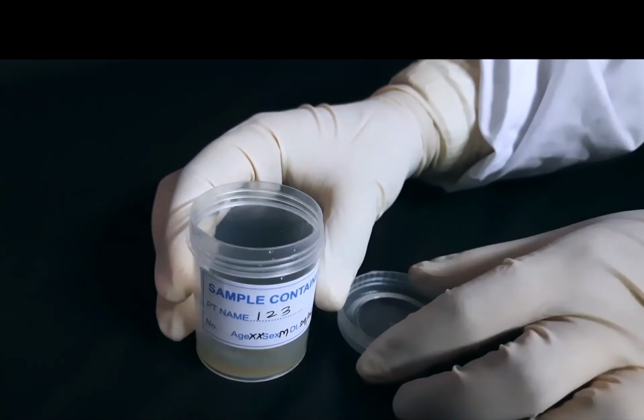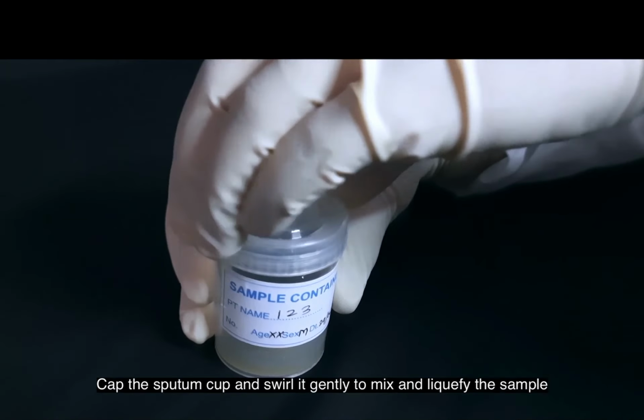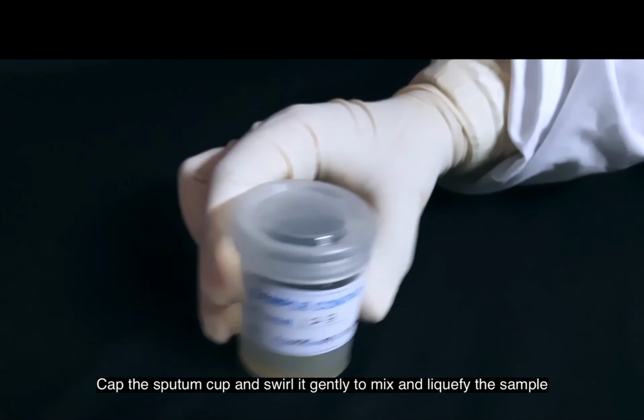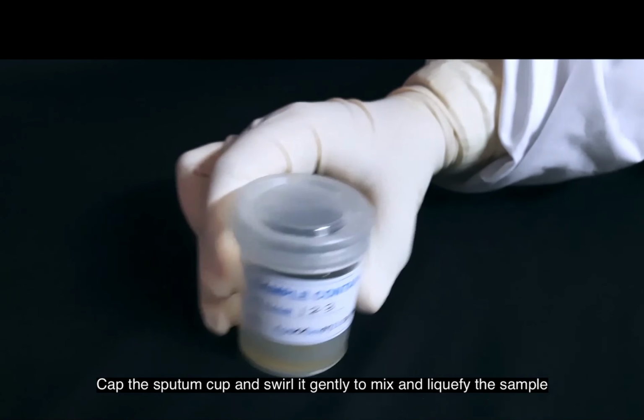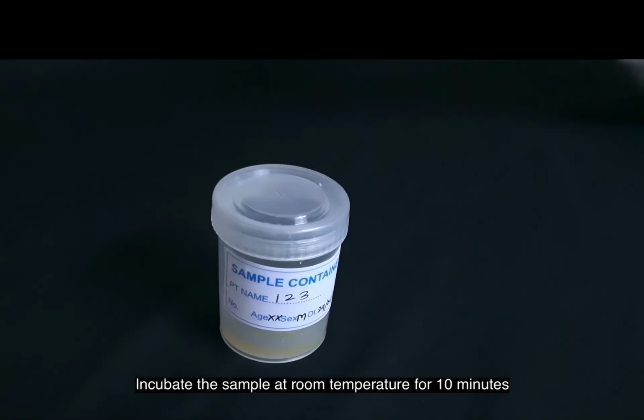So once you have put it, you close the container tightly. Then you have to mix slightly. Gently mix, you don't have to shake it. Mix slightly so that the chemical is mixed with the sample and it liquefies. And incubate it at room temperature for 10 minutes.